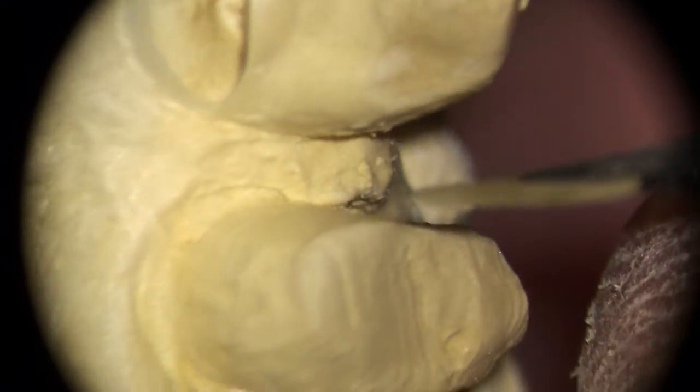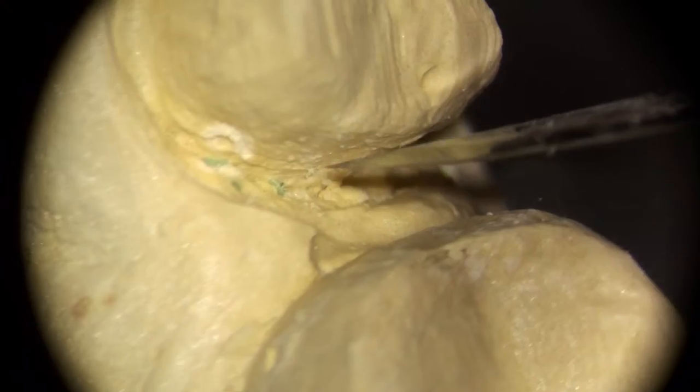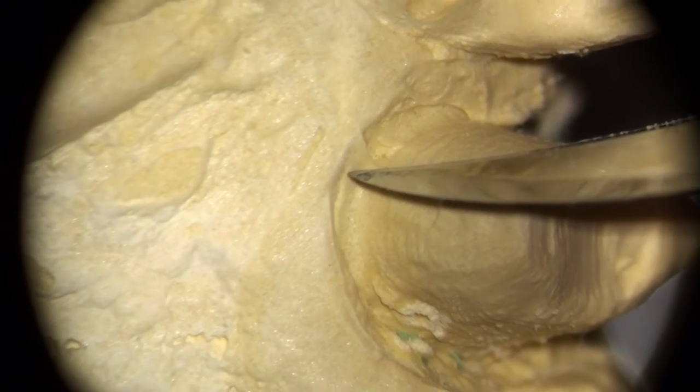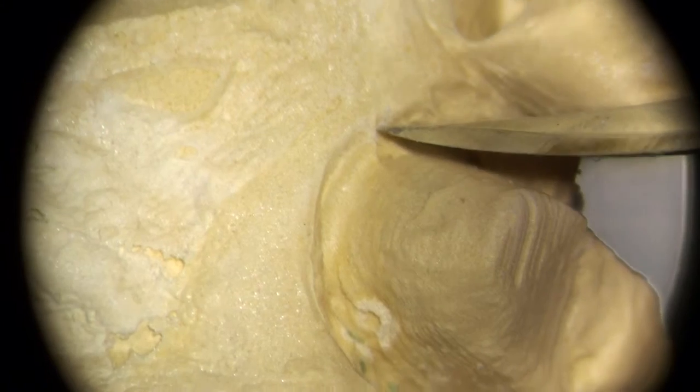And then the hard part here is going to be figuring out where the gums are in some of these other places. So we have to compare the texture on our prep to the texture of the gums. And also assume that most of the time it's going to be very natural curves to work with. So this little drag right here, we can kind of trim that up.